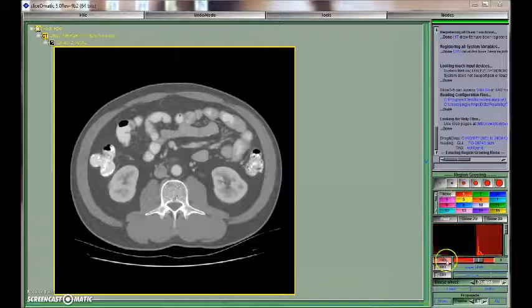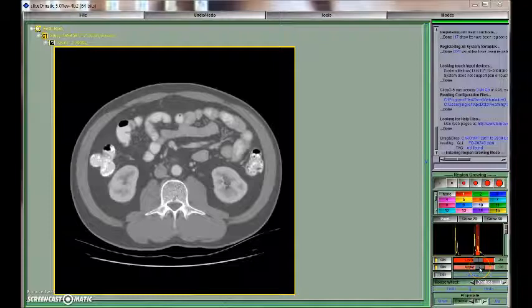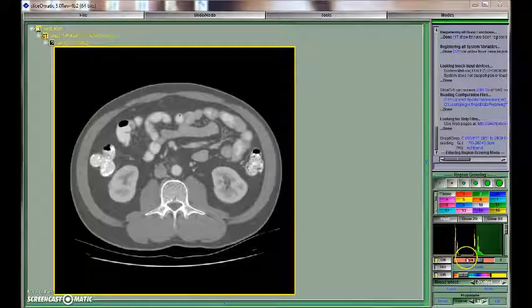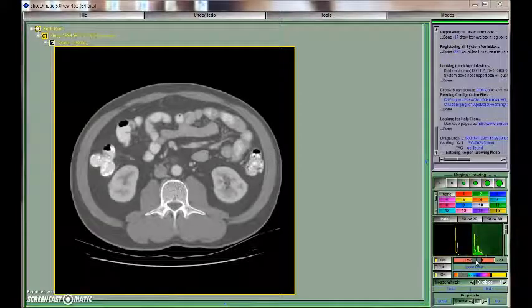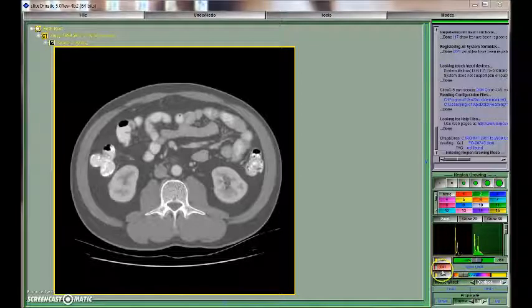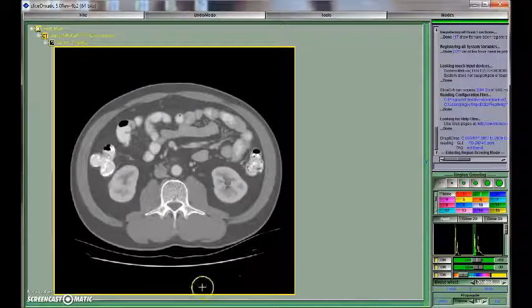In this example we are setting the Hounsfield Unit attenuation values of skeletal muscle, both the upper and the lower limits. Now we are defining the Hounsfield Unit attenuation values for intramuscular adipose tissue, and then we can proceed in defining the values of both visceral and subcutaneous adipose tissue by choosing different colors so that they can be quantified separately.